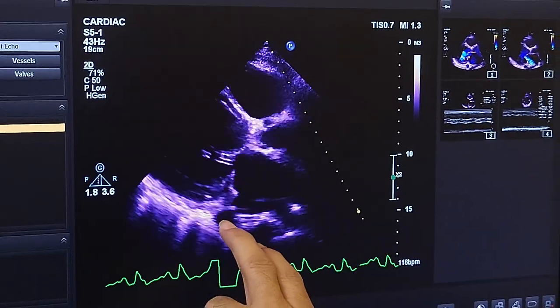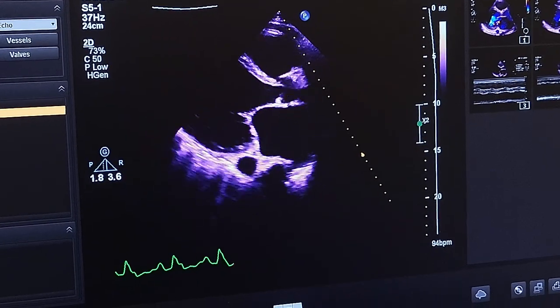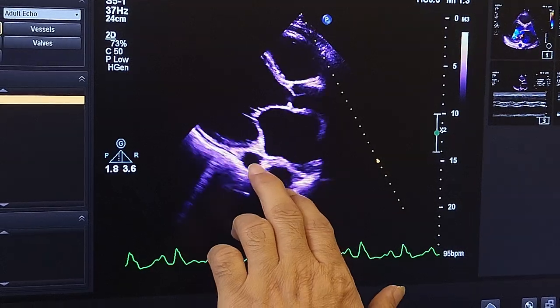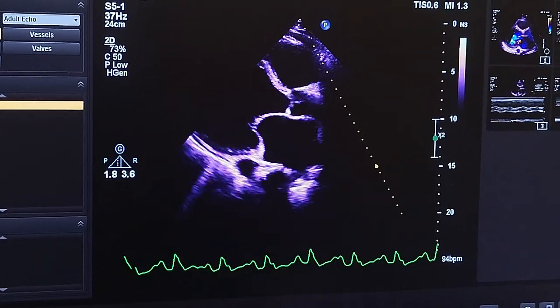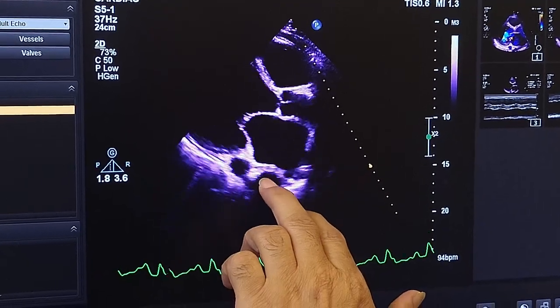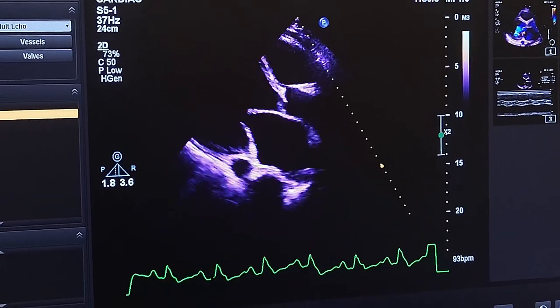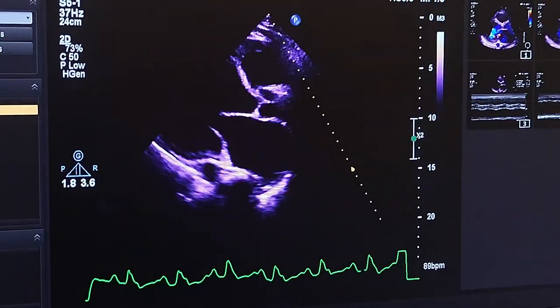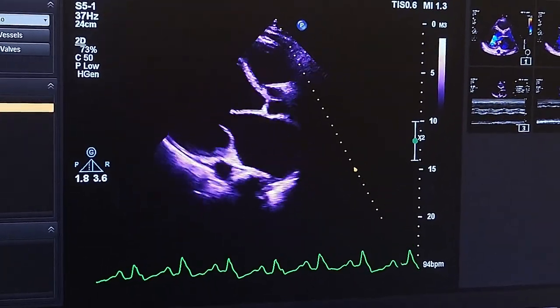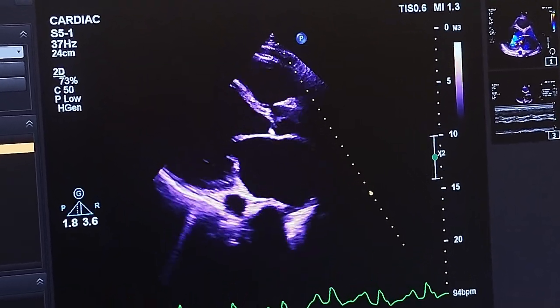And this descending aorta, we have to identify which one is the descending aorta or the coronary sinus. And the coronary sinus is usually at the base of the PML. So this is the coronary sinus, also dilated, and this is the descending thoracic aorta. Coronary sinus dilatation, all of us know persistent left superior vena cava, a congenital anomaly, causes dilatation of the coronary sinus. But the most common cause of dilatation of the coronary sinus is congestive heart failure. You have to keep that in mind.